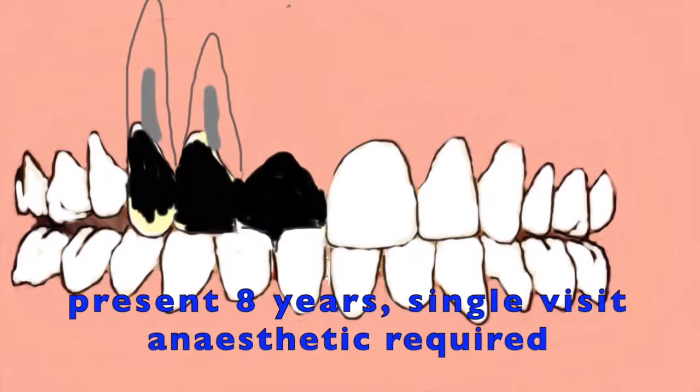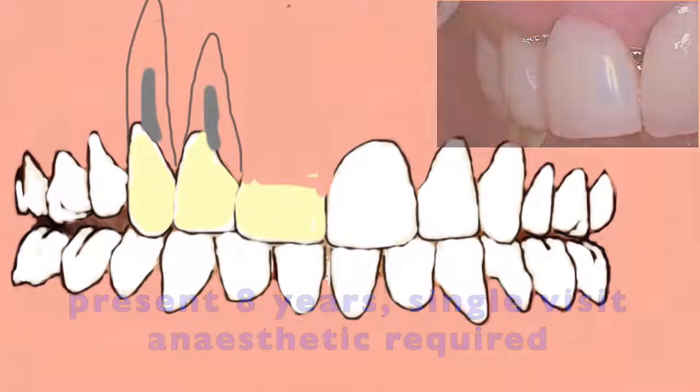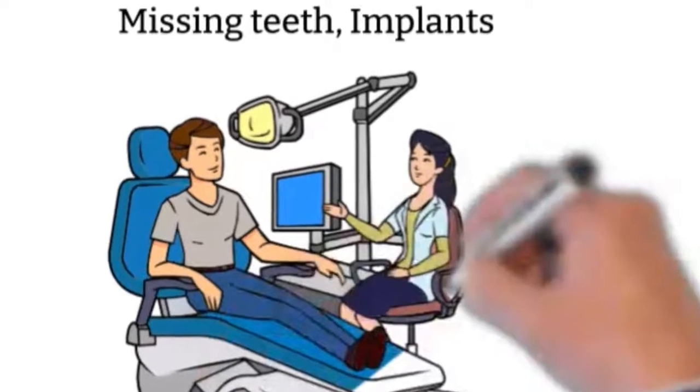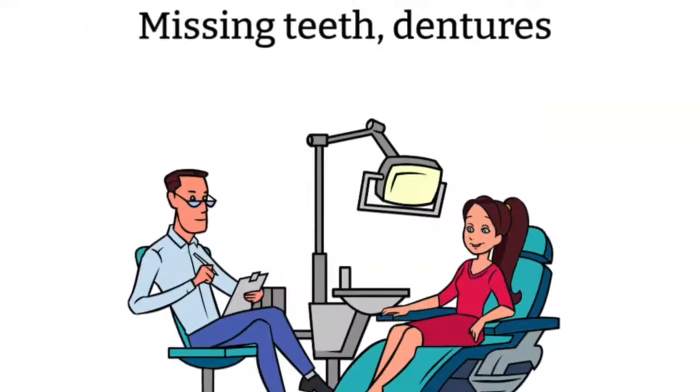And so in this instance the bridge is made out of plastic, but it has lasted about 8 years and is not as expensive as an implant retained bridge, but more expensive than a denture.